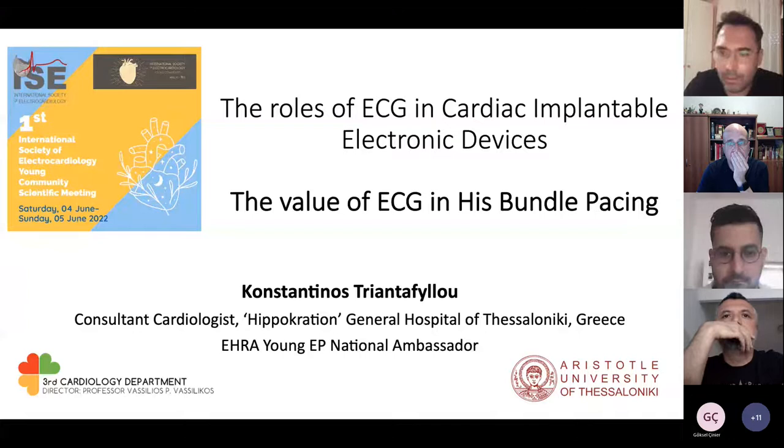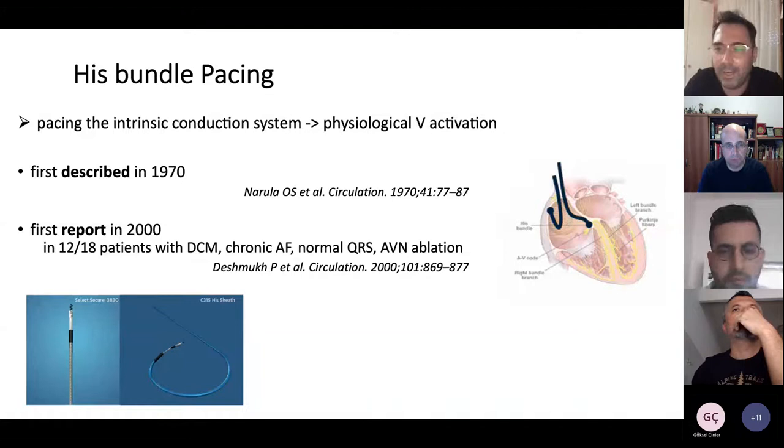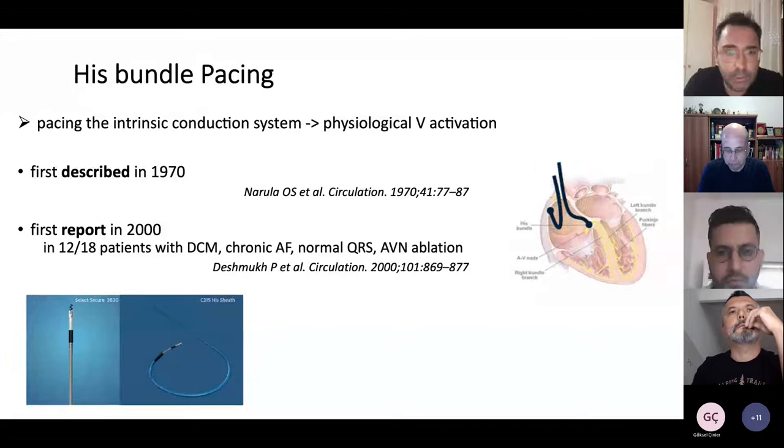and His bundle pacing. I will start with the interesting concept that pacing the intrinsic conduction system offers a physiological ventricular activation, which is very attractive. It was first described 50 years ago, but the first reports occurred 20 years ago. It needed some years for the manufacturers to make dedicated leads and sheaths. And nowadays, many centers use His bundle pacing as a standard procedure.